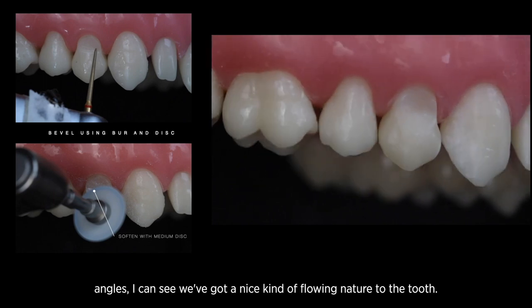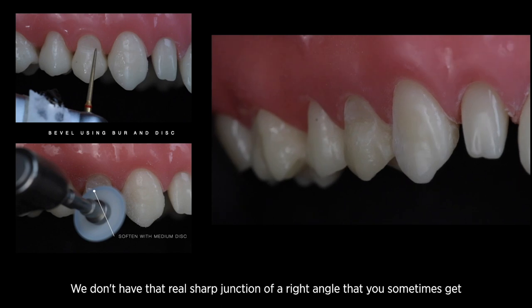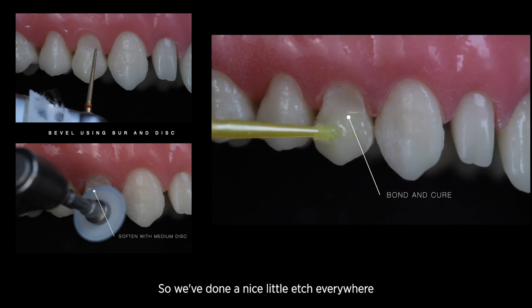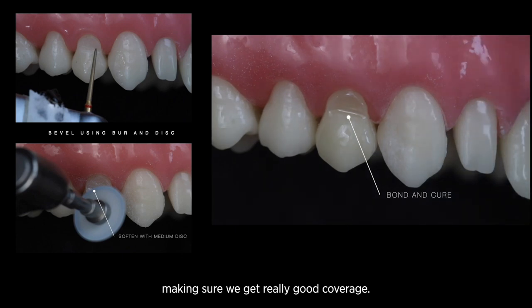When I look at that from all angles, I can see we've got a nice flowing nature to the tooth — we don't have that sharp right-angle junction you sometimes get with Class 5s. We've done a nice etch everywhere and then we're coming in to bond and cure, making sure we get really good coverage.